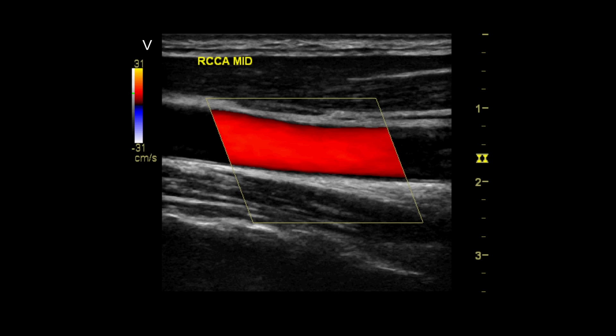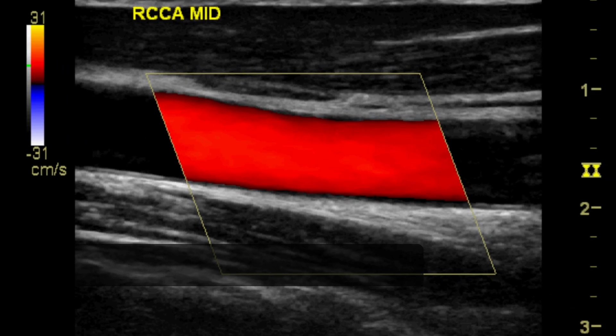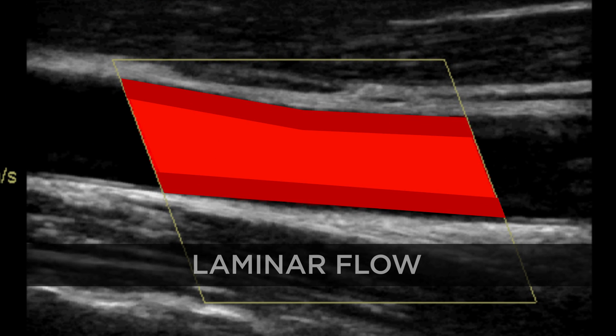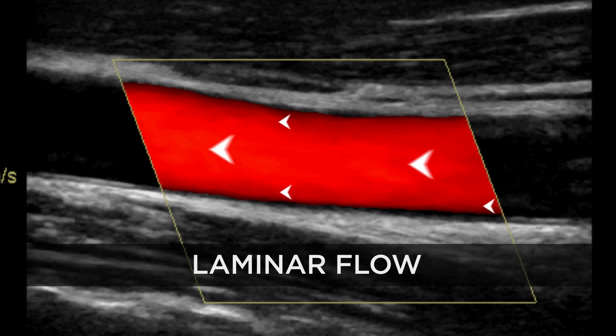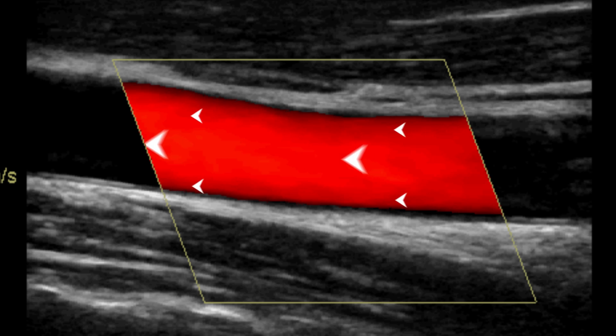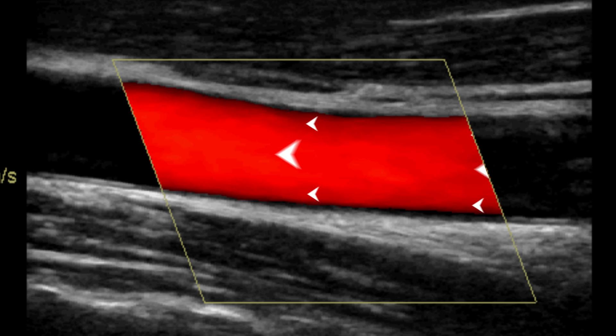Adjust the color gain if necessary, so that color only appears in the lumen of the vessels, not outside of them. The normal CCA has a laminar flow pattern. This means that flow velocity in the center of the vessel is higher than near the wall of the vessel.